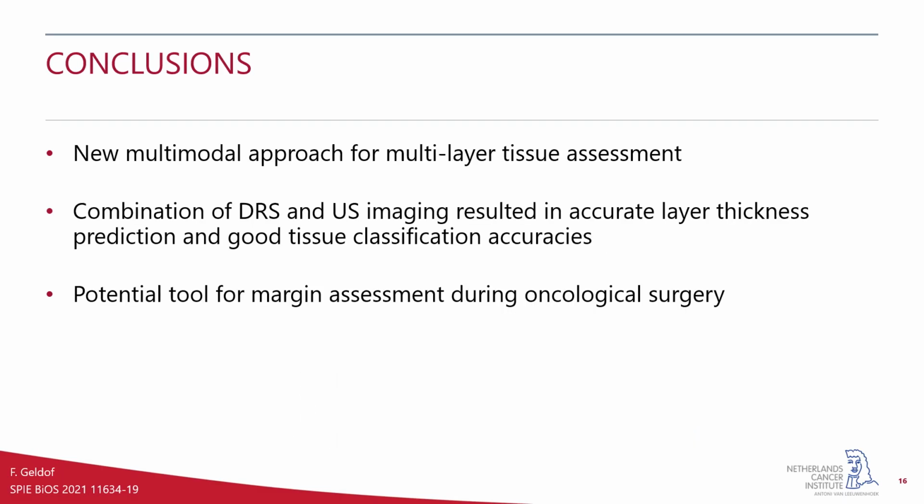In conclusion, we proposed a new multimodal approach for multi-layer tissue assessment. The combination of DRS and ultrasound imaging resulted in accurate layer thickness predictions and good tissue classification accuracies. This shows its potential as a margin assessment tool during oncological surgery.